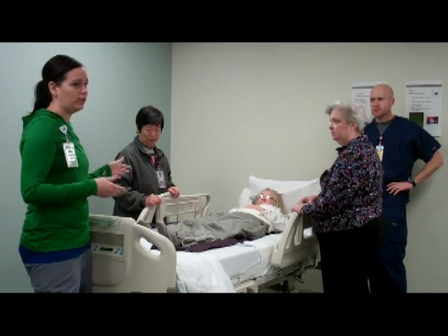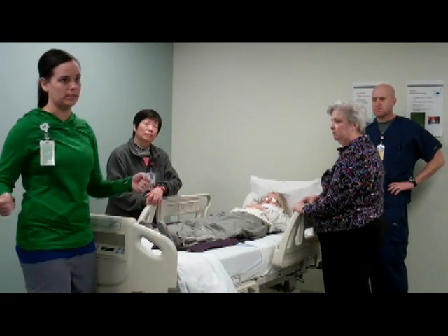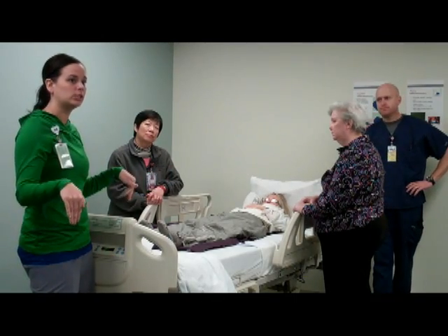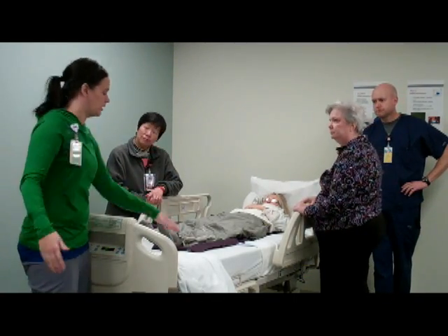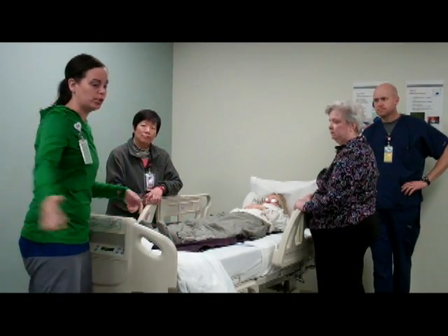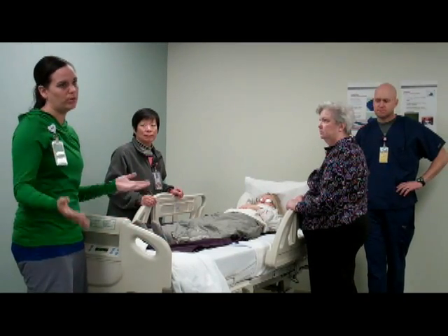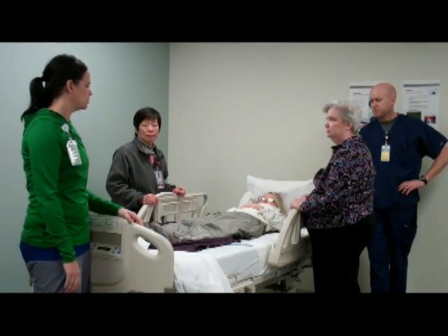And if you're getting her up, it's great. You know how their butts always get stuck and then you have to wrench them around to get their legs hanging over the edge of the bed. Just a little something like this underneath their butt will make turning them to the side of the bed so much easier. So it's one of those extra little tools.